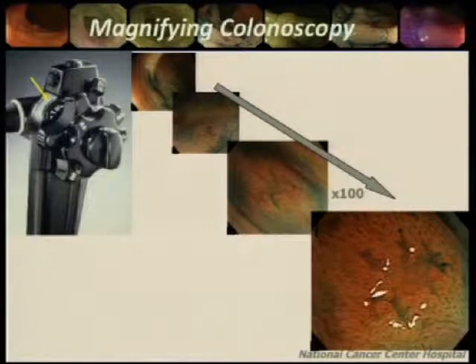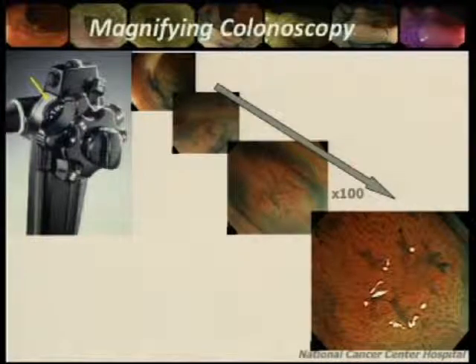So we are using magnification colonoscopy routinely. This endoscopy enables us to diagnose the histology accurately, just by pushing down this knob.